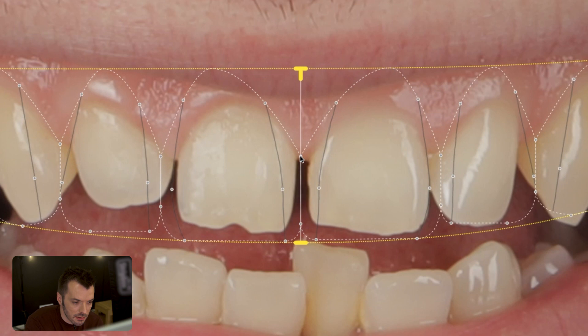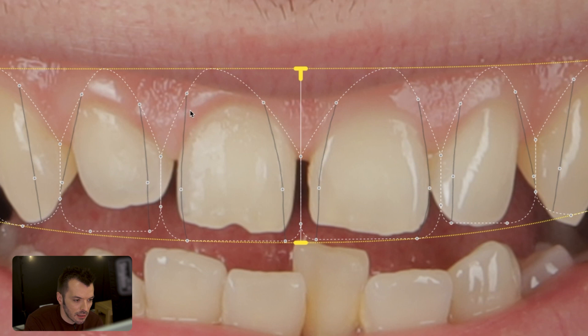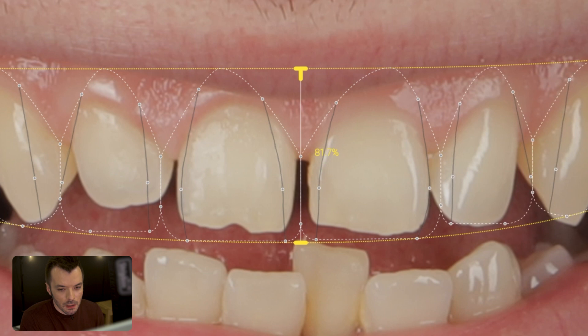For a finer level of detail, I can adjust things like papillas and line angles, which are relevant when doing crown lengthening. You have to understand that the line angle architecture of the existing teeth always converges in the root, giving you an idea of where you can place a prep line. For example, if the tooth converges underneath, you will never realistically be able to place the prep line there, so try to follow the clues that biology gives you.